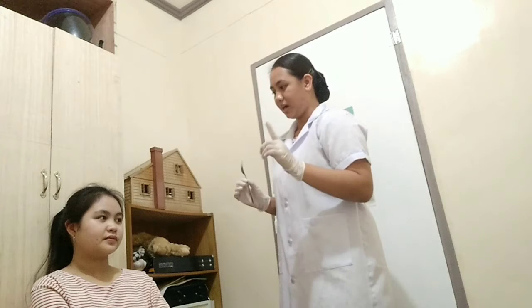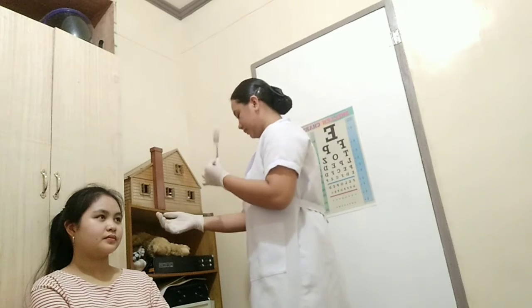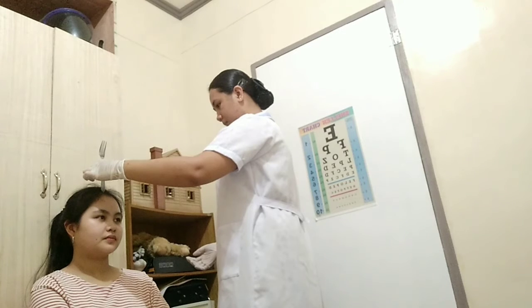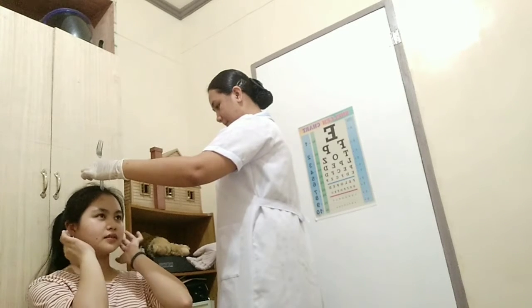Ma'am, mag-signal po kayo sa akin if marinig niyo po both ears yung vibration po, ma'am. If hindi, magsabi lang po kayo sa akin kung asan po yung may hearing loss or wala. Let's see. We are going to start with the Weber's test first. Both ear.